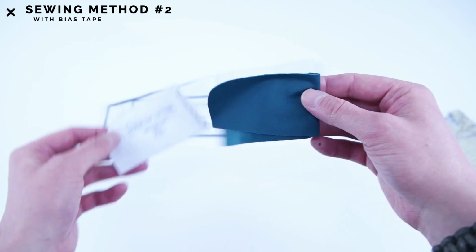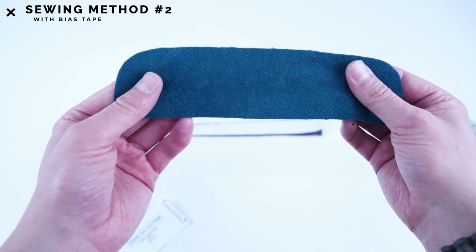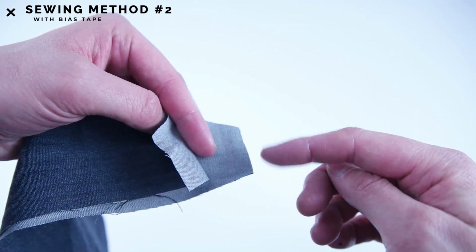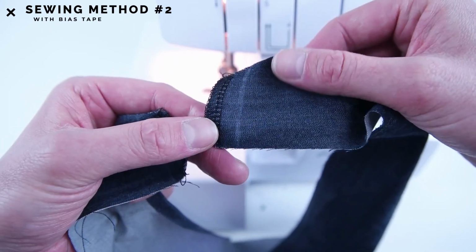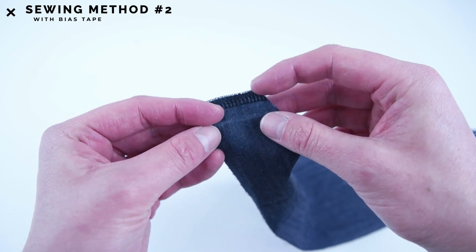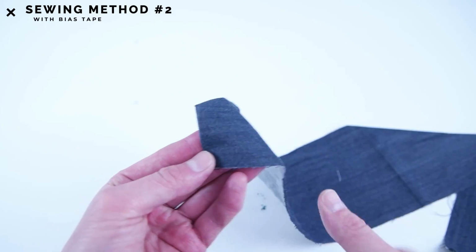And one sweatband panel cut on the fold. We're going to start by serging both the outside edges. And if you don't have a serger, a zigzag stitch will do just fine. Roll the two edges over on the hemlines, place pins, and sew at a 1/4 inch from the edge.